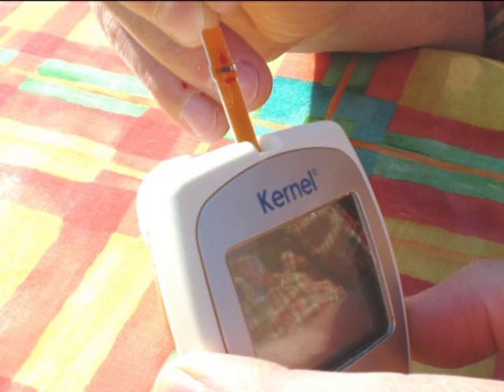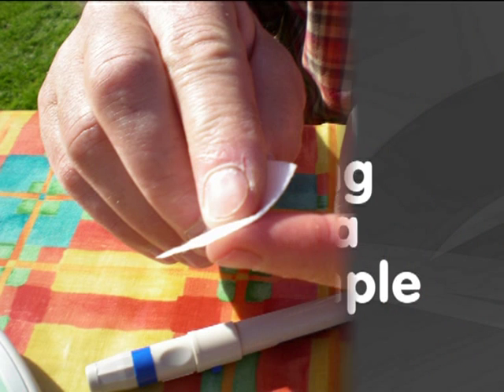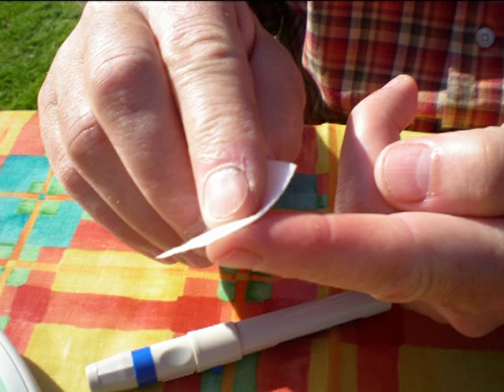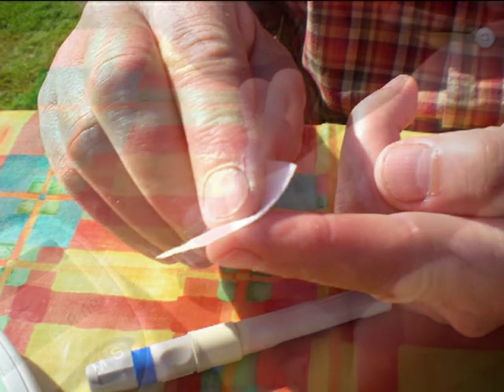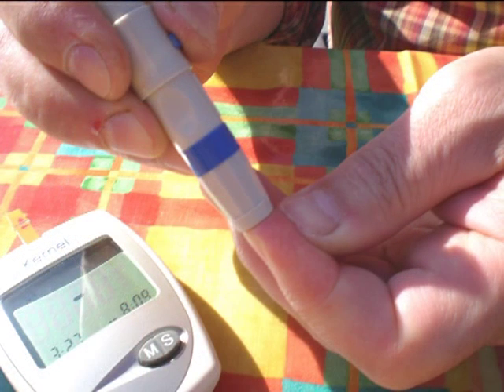Once the strip is inserted fully, the meter will first display the code number, then the blood symbol along with the date. To get the blood, you first need to clean your finger with an alcohol swab. You can use any finger for this test, and we recommend that if you test regularly, you alternate the finger you use. Once your finger has dried from the swab, you can then take the test. Before you prick your finger, shake your hand to get the blood to the end of your finger, then gently massage it so it goes a nice bright red. Put the end of the lancing device on the tip of your finger and push down, then press the blue button to release the point.